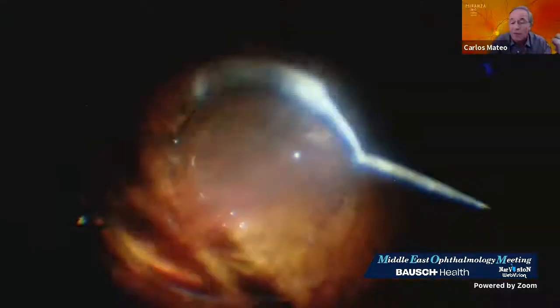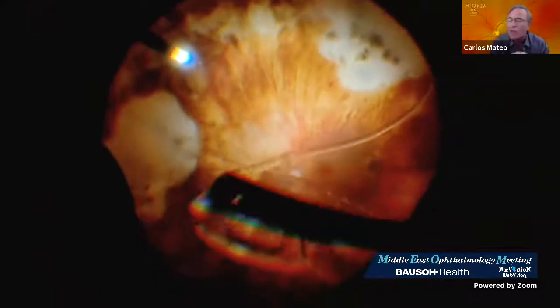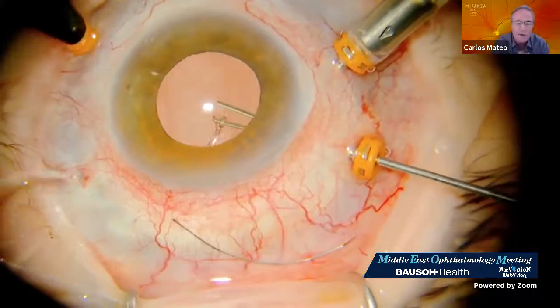My preferred technique at this moment, I have two or three techniques, but one of the most used is the iris suture. There are some surgeons who prefer not to remove all of this, but I remove everything. I remove the cortical material, the capsules, and the ring. I use two forceps trying to avoid hitting the retina, and then I clean the lens.